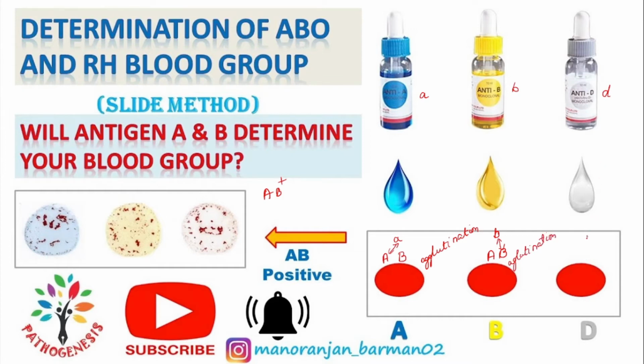And coming to here, antibody B is coming here, and here are present antigen A, antigen B, and also, corresponding to the anti-D, there is another antigen. I forgot to mention that. That antigen's name is Rh antigen. As Rh antigen is present here, this antibody interacts with this Rh antigen and will result in agglutination.